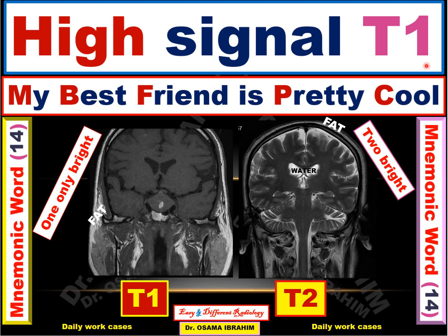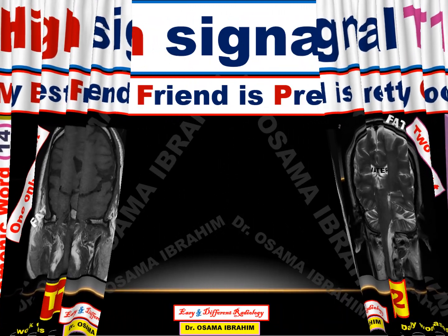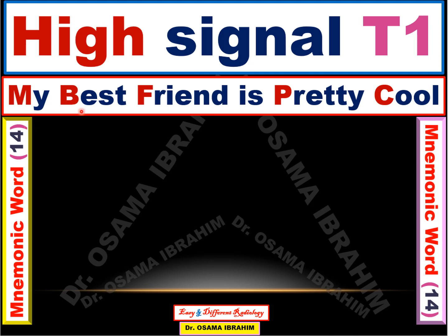Our topic today is about T1, like this image, and anything appearing bright like this hemorrhage in the image, we consider as one of the differential diagnoses, which is remembered by the mnemonic: My best friend is pretty cool. So, what is the differential diagnosis of My best friend is pretty cool?